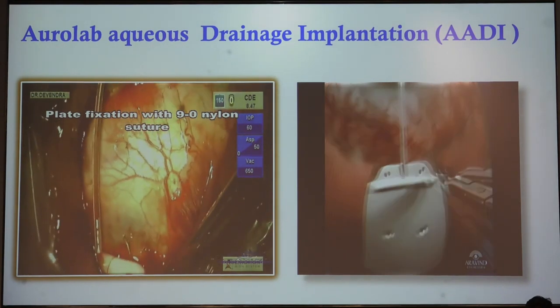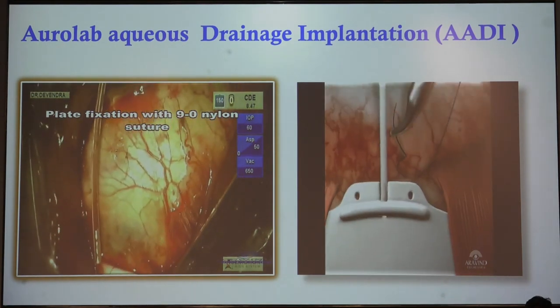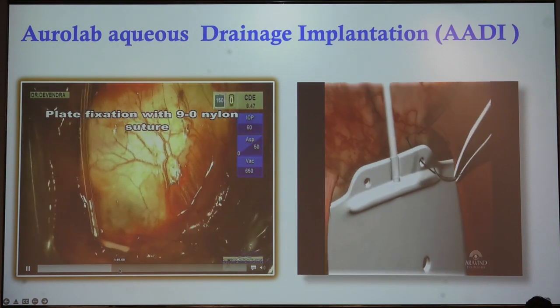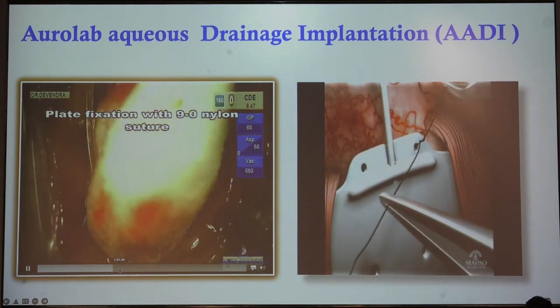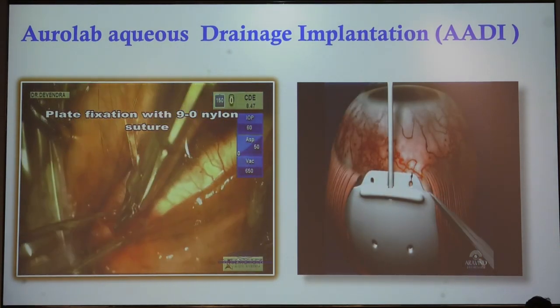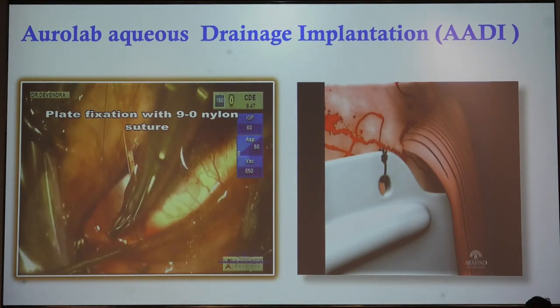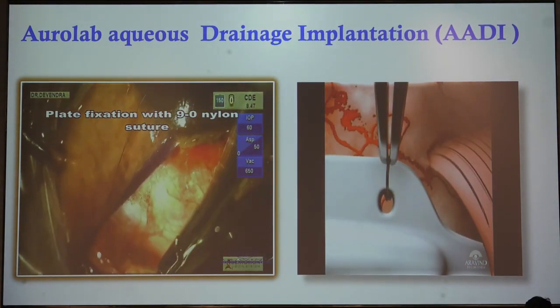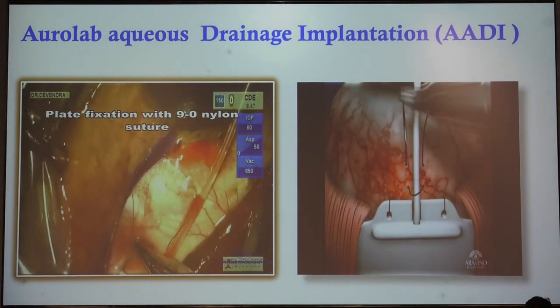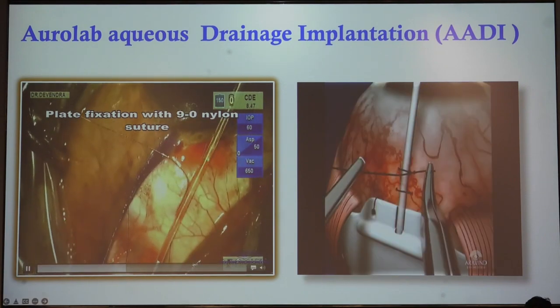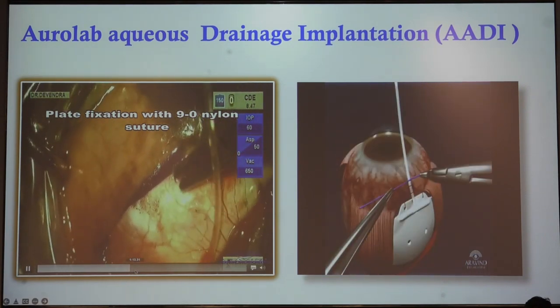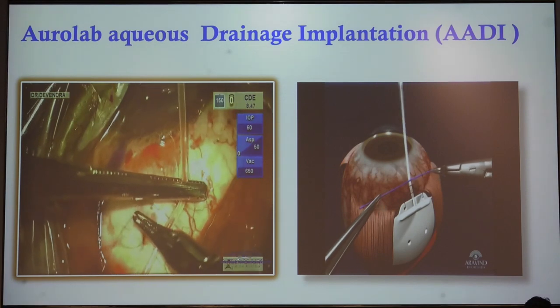The plate has to be secured using 9-0 nylon suture — two 9-0 nylon sutures. Take the first sclerotomy bite first, then come through the hole in the RD plate. The knot automatically goes inside, so there is no need to struggle with burying the knot. You can then cut the knot.